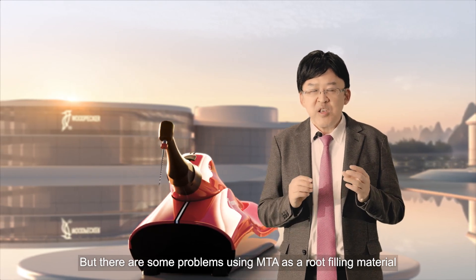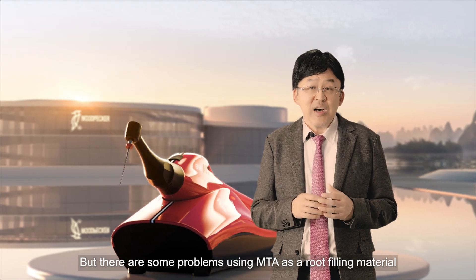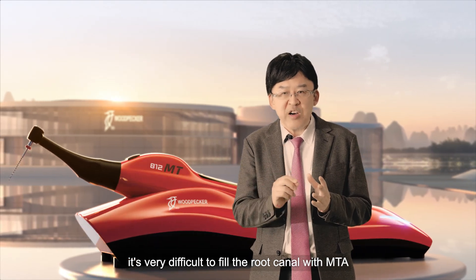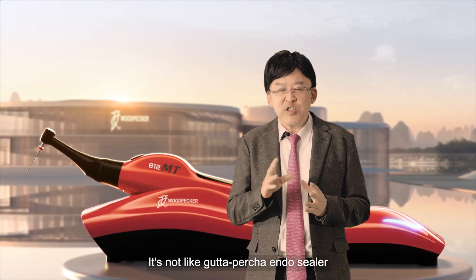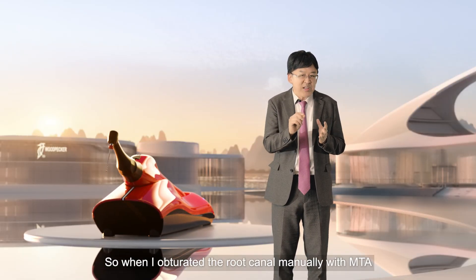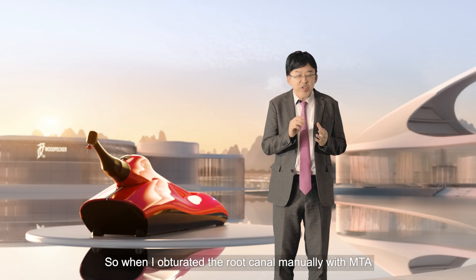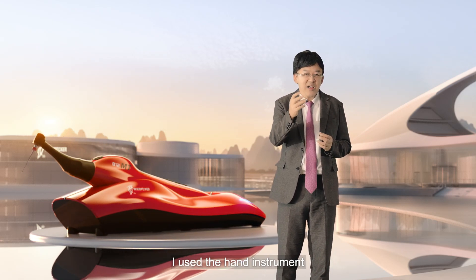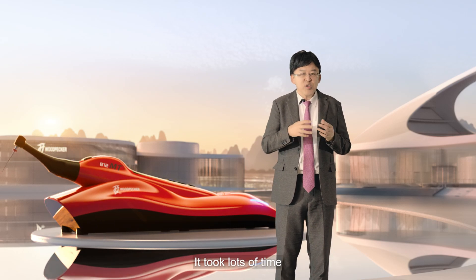There are some problems using MTA as a root filling material. First, it's very difficult to fill the root canal with MTA — it's not like Gutta-percha and Sealer. When I obturated the root canal manually with MTA using hand instruments, it took a lot of time.